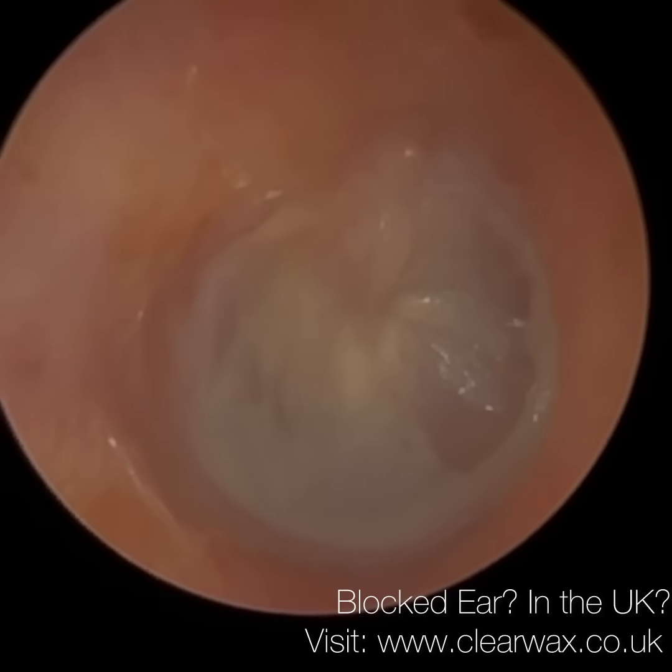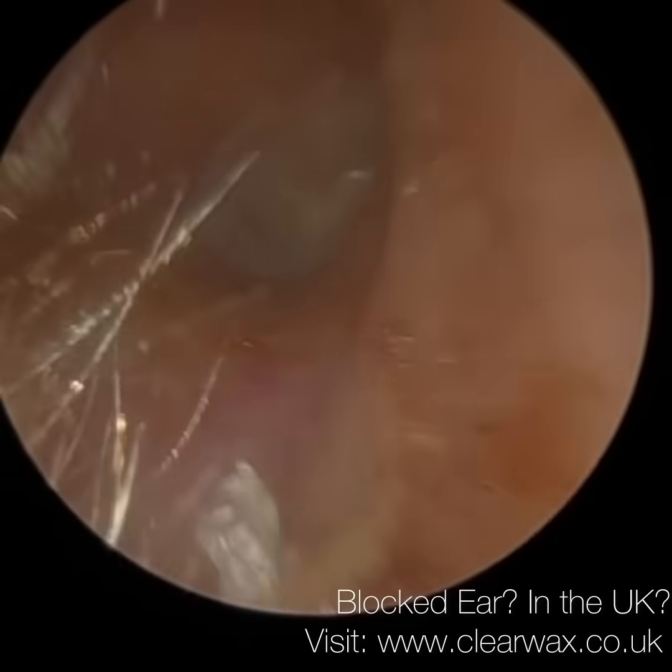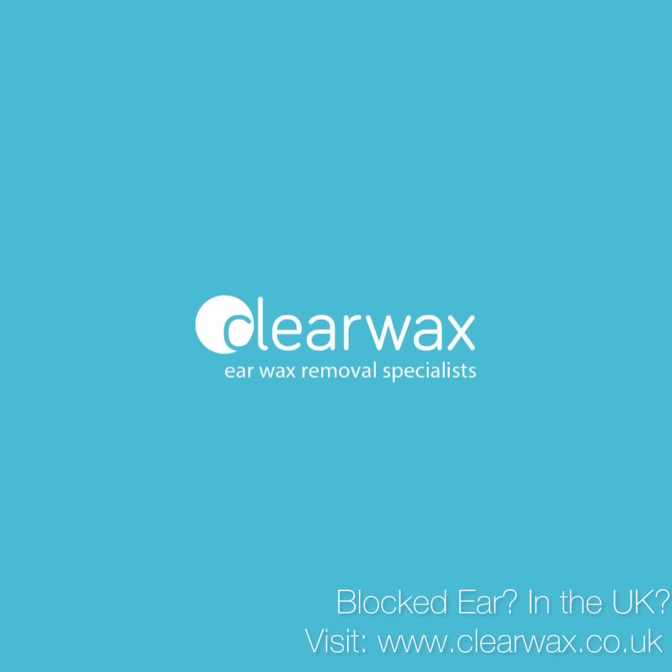They've got a bit of tympanosclerosis, so some scar tissue posteriorly. Anteriorly, the eardrum's quite thin, but you would have seen that circular, more round shaped ear canal as opposed to it being an oval shape.